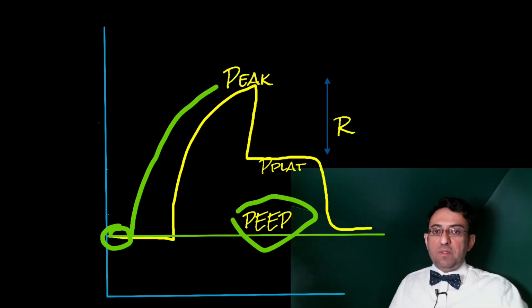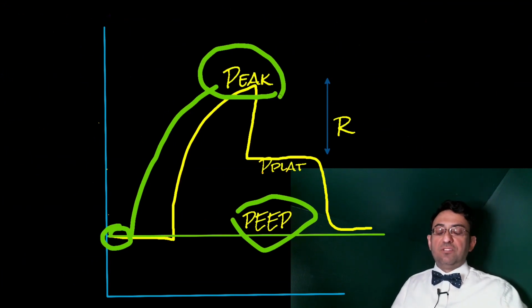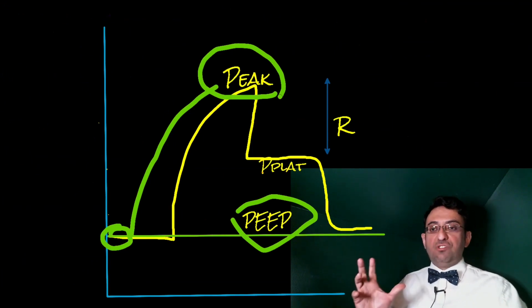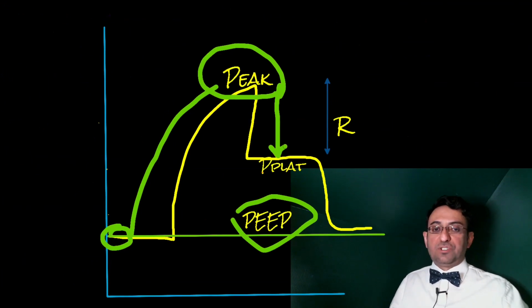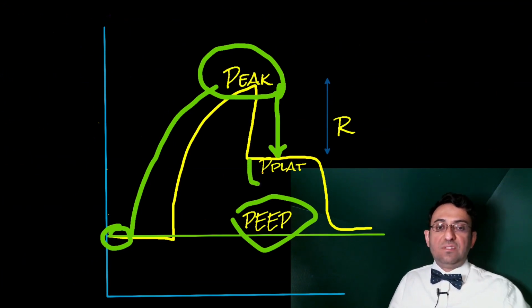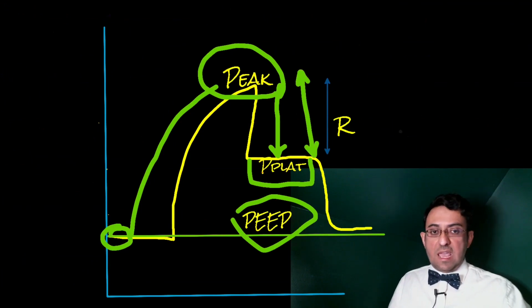So if at the moment of peak airway pressure, which is also known as peak inspiratory pressure, we stop breathing and have the patient take an inspiratory pause, there will be no resistance, and therefore the pressure drops to a value that is only associated with the alveolar recoil pressure. That value at zero airflow is referred to as plateau pressure.